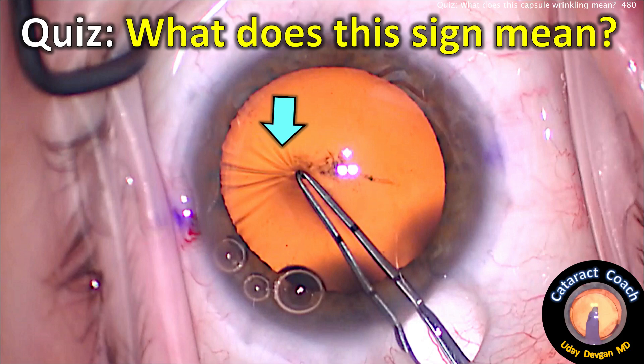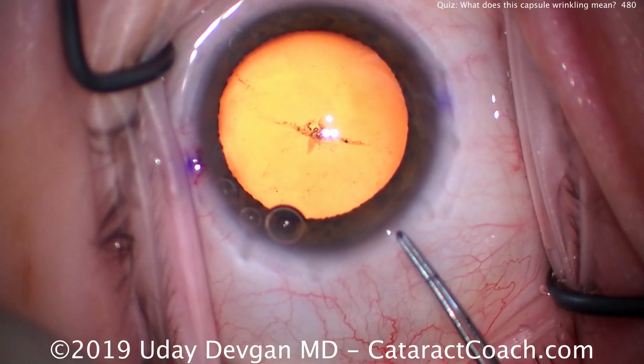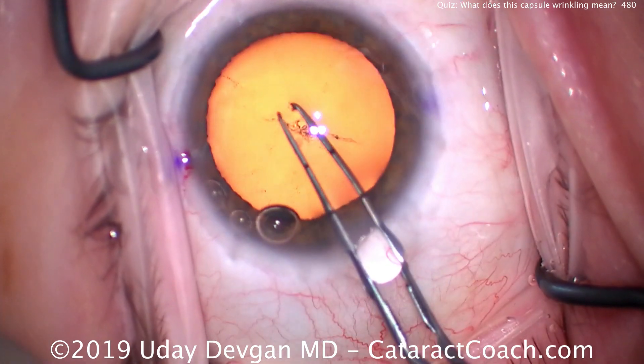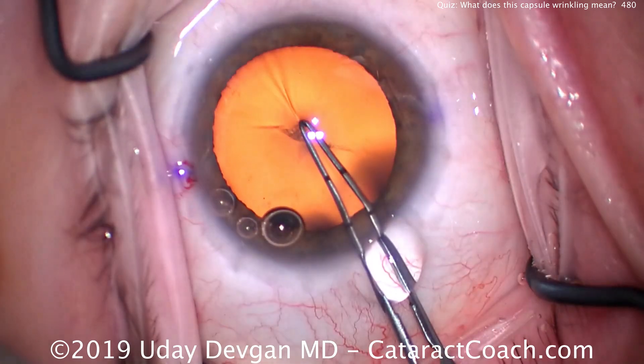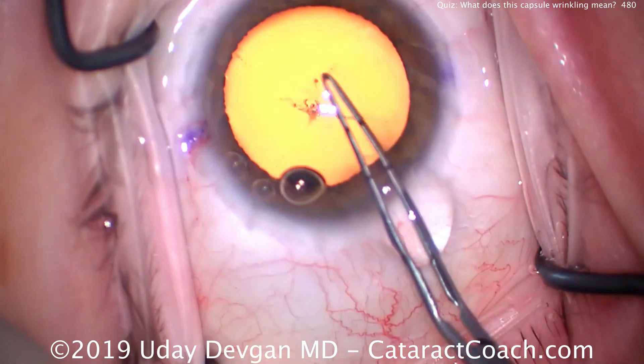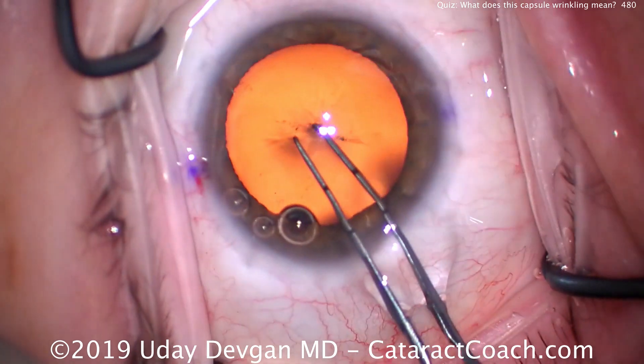CataractCoach.com quiz: what does this sign mean — that wrinkling there on the anterior lens capsule? When we start the rhexis we tap and try to puncture the lens capsule, but as we try to puncture it, a lot of wrinkles appear. I check all over and there are still a lot of wrinkles.